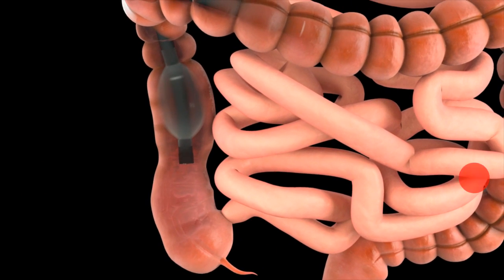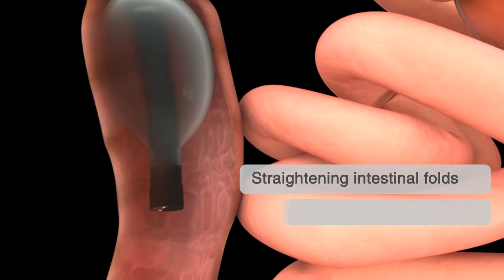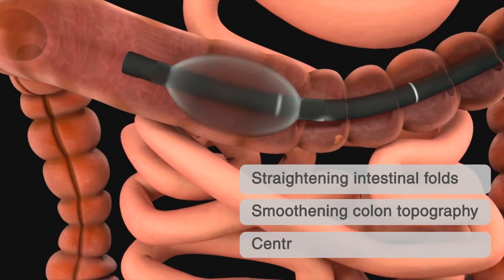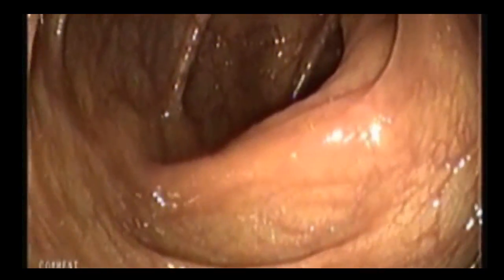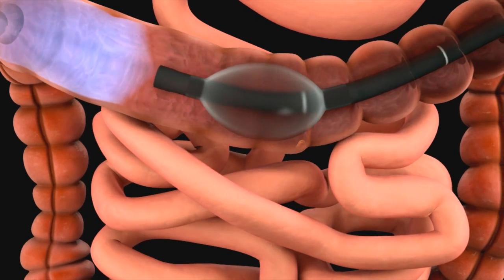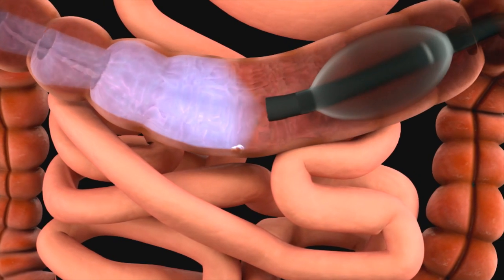While the endoscope is withdrawn, haustral folds are straightened and lumen topography is smoothened. The partially inflated balloon centralizes the endoscope optics and enhanced lumen visibility is obtained. Polyps which are located behind colon folds or masked by lumen topography can now be detected.